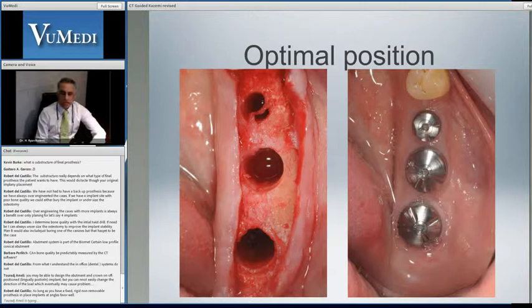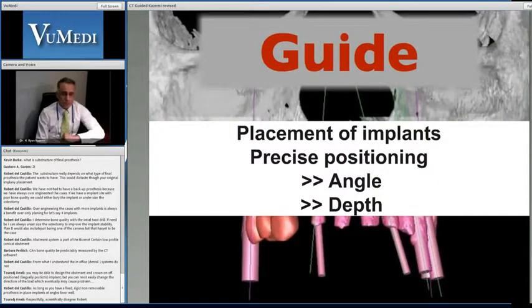and this really makes not only the job of the restorative dentist easy, it makes the restorations normal in contour and easy to clean. It'll look great, and it'll certainly add longevity and long-term results. And this is what we're looking for.